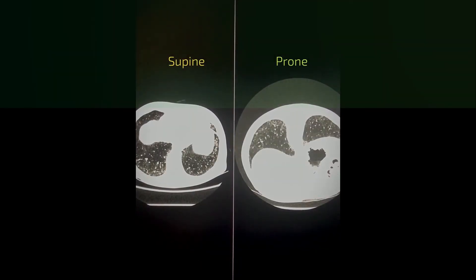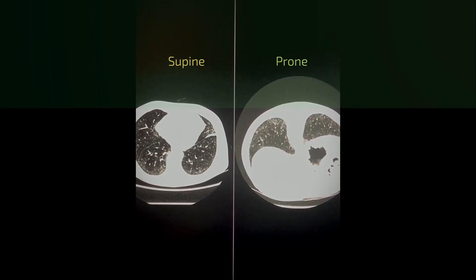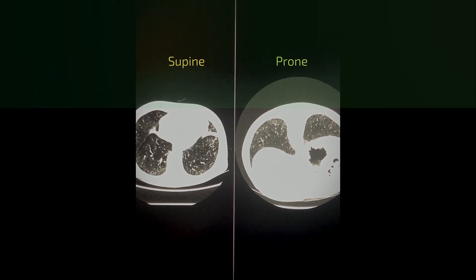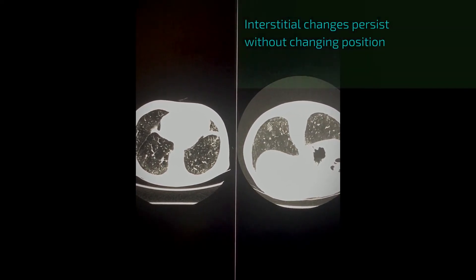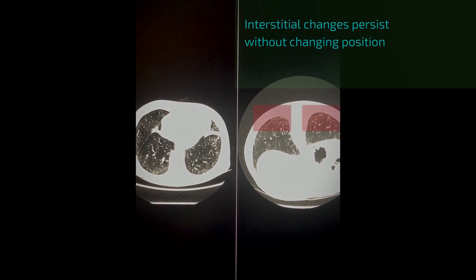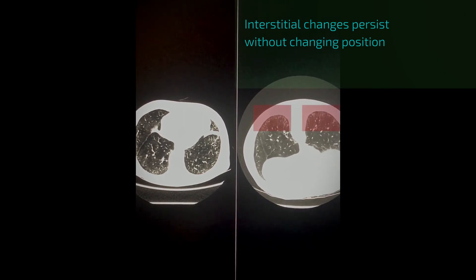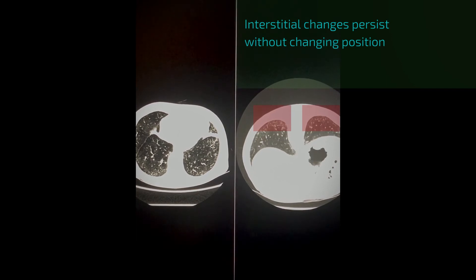We have a supine acquisition and a prone acquisition. In the event of gravity-dependent atelectasis, these changes would drop down to the opposite side of the lung. In this case, they prevail on the non-gravity-dependent posterior basal lungs, which, in combination with the other features, is more confirmatory of an interstitial lung abnormality rather than gravity-dependent atelectasis.